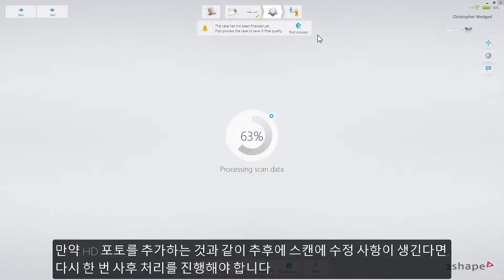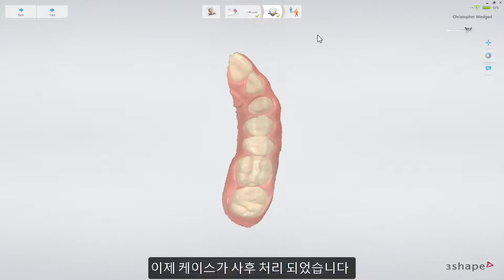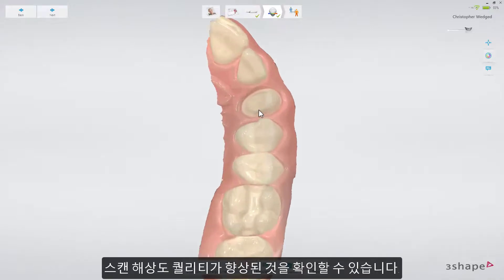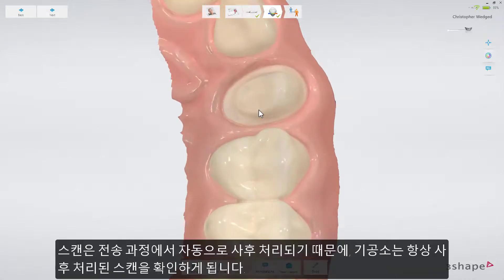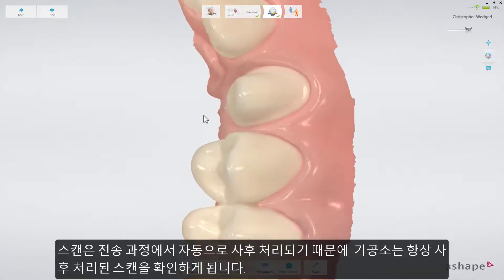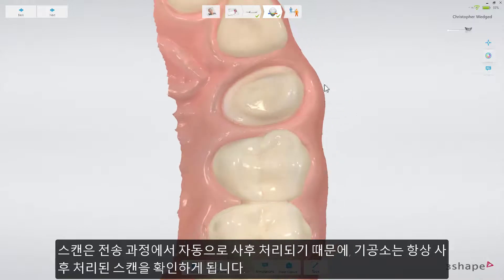If you implement any modifications of the scan later on during work — for example, adding a HD photo — you'll need to do post-processing once again. Now the case is post-processed. Note how the level of detail has now increased. The dental lab will always see the post-processed scan, because it is automatically processed during the sending procedure.